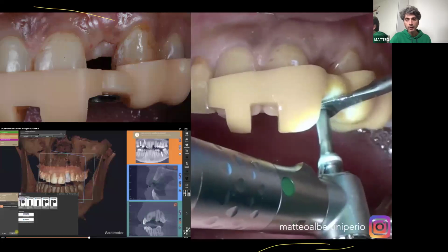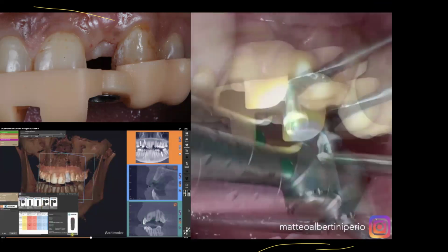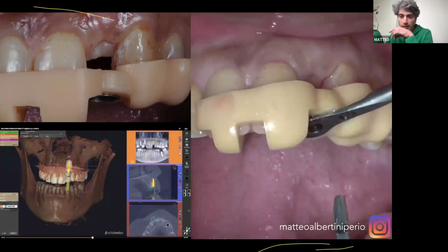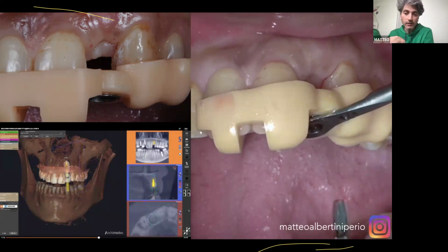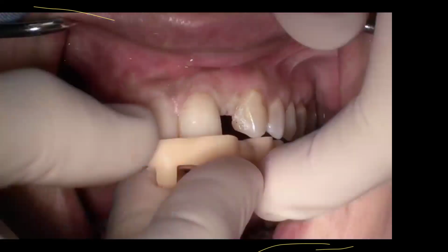Now we can go to the implant placement. Сейчас переходим уже к этапу установки имплантата. In this case, you only have to use 2 drills because it's a 3.1 implant. В этом случае буквально два сверла мы будем использовать, потому что диаметр имплантата 3,1. And I haven't used the second drill to the end, as you saw in the video. И второе сверло я не использую до конца, как вы видели это на видео.